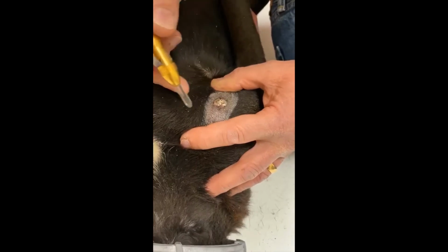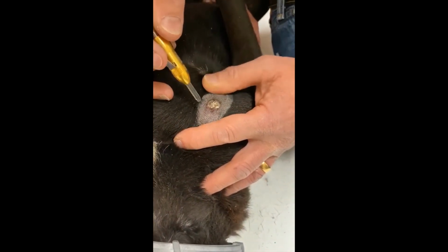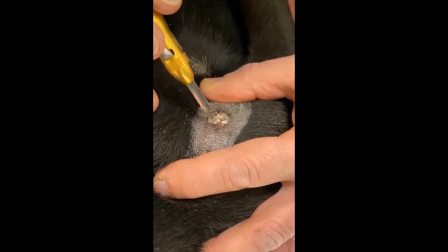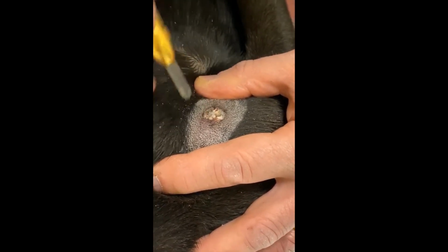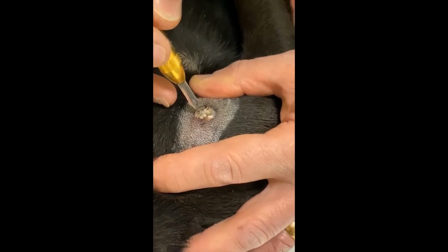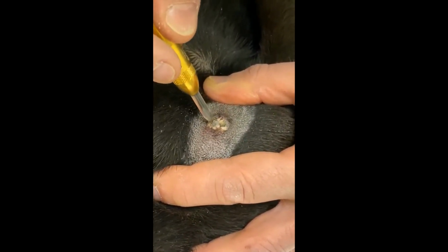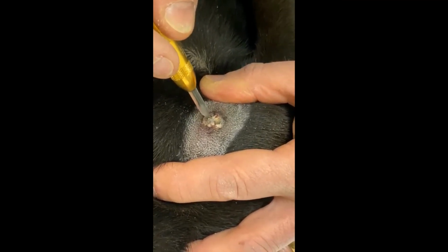So we've just completed the thaw cycle, which typically is 1 to 2 times the duration of the freeze cycle. You'll notice that I'm not wearing gloves. I typically don't wear gloves, so I have a comfort level with the temperature of the surrounding skin. Again, this mass is very broad-based, but not very thick, and as a result I want to move quickly to freeze the mass and not to freeze the surrounding skin.